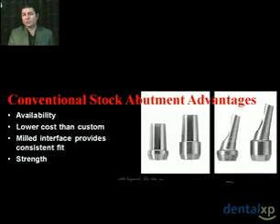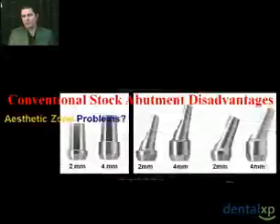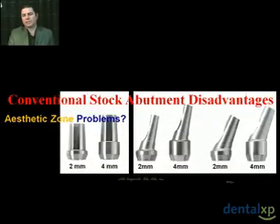There are advantages with conventional stock abutments, essentially availability. They are generally lower cost than custom abutments when utilized correctly. They have a milled interface providing a consistent fit and also strength. But ladies and gentlemen, there are disadvantages.